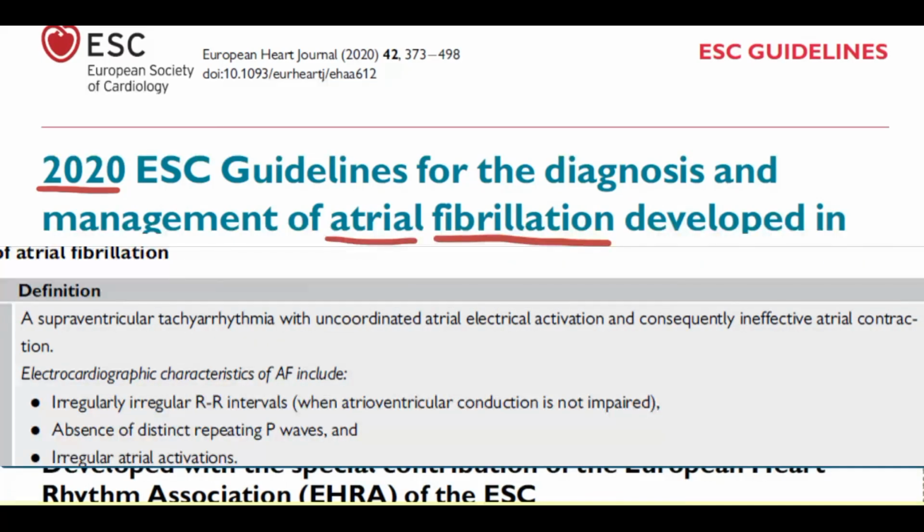Let's check the criteria of atrial fibrillation according to the ESC guideline. Irregularly irregular RR intervals when atrioventricular conduction is not impaired. Absence of distinct repeating P waves and irregular atrial activations.